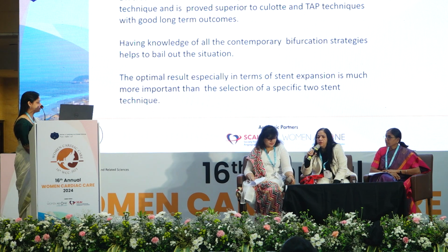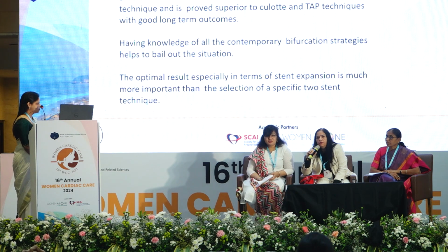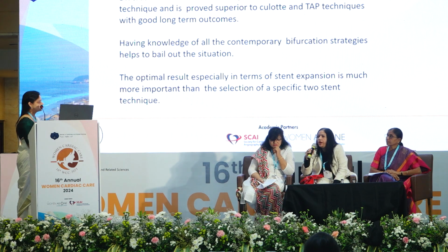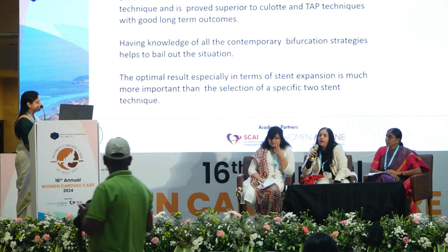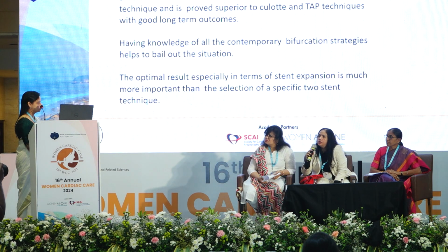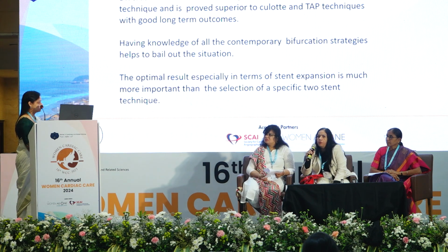Okay. One or two things: your diagonal was really big. Big. Yeah. And ostial lesions are generally very fibrotic. You try to open them with high pressure with an NC balloon, you end up dissecting. And then your entire bifurcation strategy goes for a toss. So your main crux was starting with a dissected diagonal. Yes. It could have been prevented by using a cutting balloon. So that's number one.